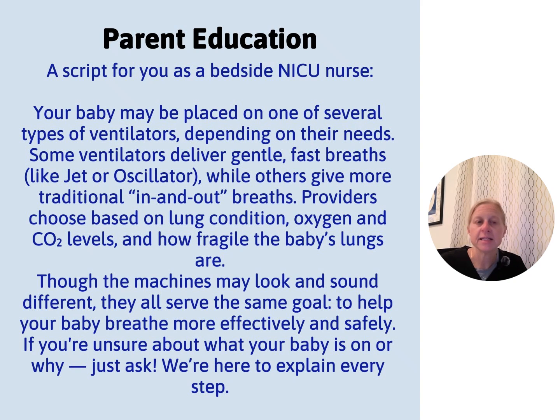So I say things like, your baby will be placed on one of several types of ventilators depending on their needs. Some ventilators deliver gentle, fast breaths, while others do more that traditional in and out like you and I do. Providers choose this based on lung condition, oxygen and CO2 levels, your x-ray, how young your baby is, what we can be doing with the fluids, if they've had surfactant. There are a lot of factors that go in. Though they all look and sound different, they have the same goal: help your baby breathe effectively and safely. If you're unsure of what's happening in here, ask us and we can help.